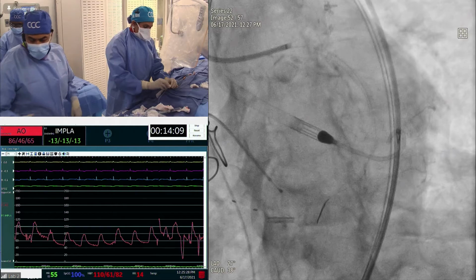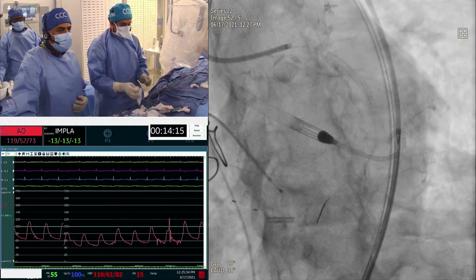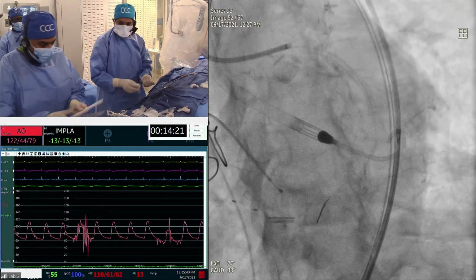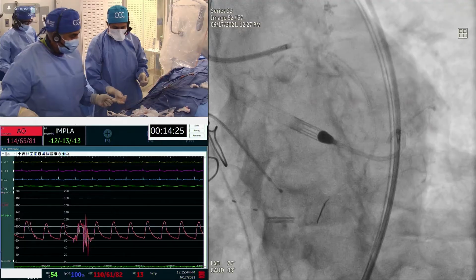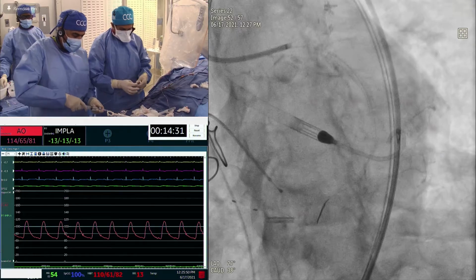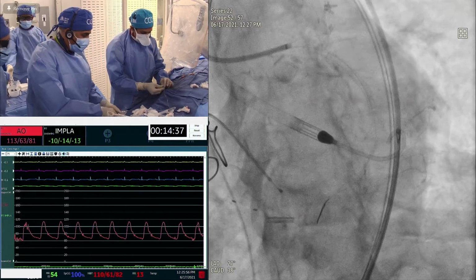Dr. Mehta? Yeah, Roxana, I think the distal to the stent will be all right. To me, the whole teaching part of this whole case was the use of Impella. Look, the traditional thinking was EF is 40-45%, you could probably get away. But a lot of these maneuvers, including the deep throating with the Guidezilla as well as the use of rotablator, I think the Impella made it all possible. I think it gives it a very clear-cut way.